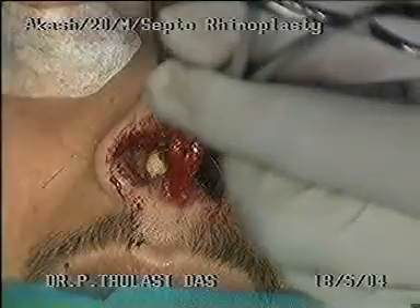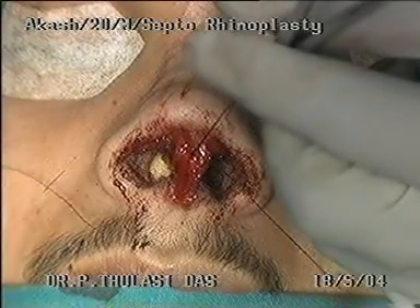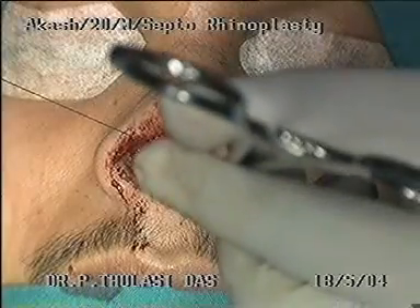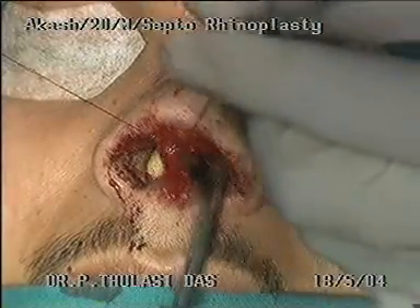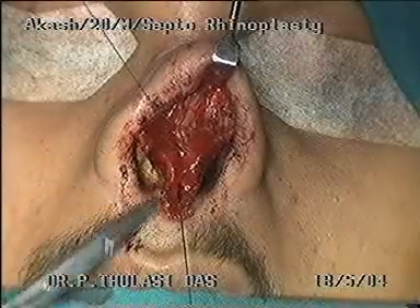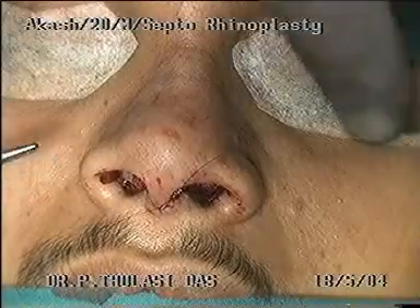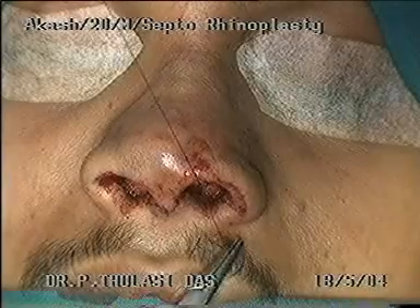While the assistant is applying constant traction, the septum is quilted in several places with 4-0 chromic catgut. The divided dorsal components are sutured together. Once the cartilage is fixed in place, the traction suture is cut and removed. The flap is replaced and sutured with ethilon and catgut to produce the final result.